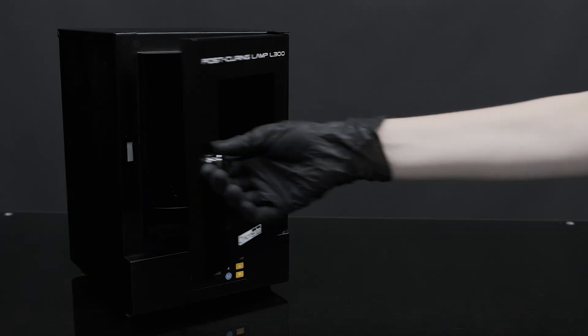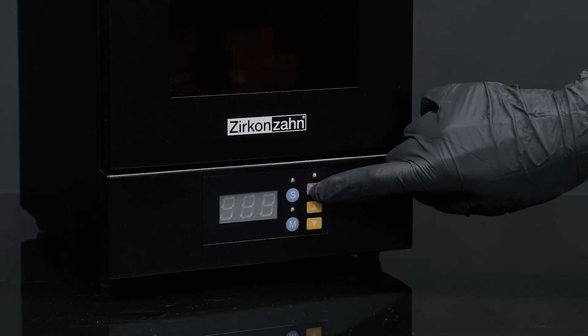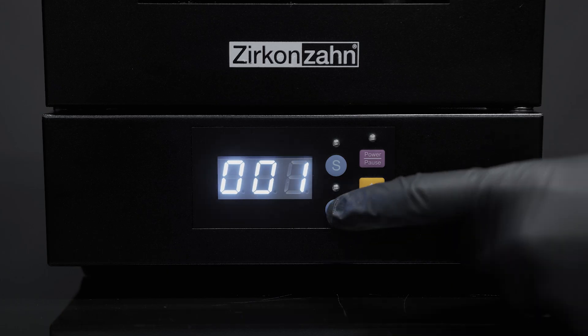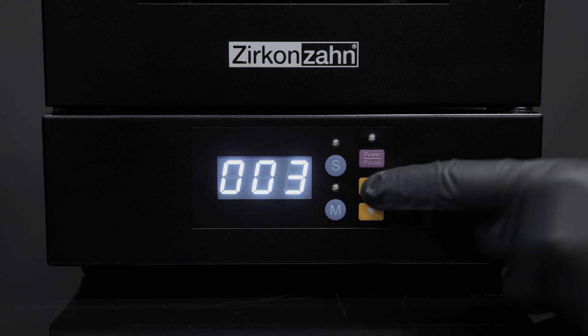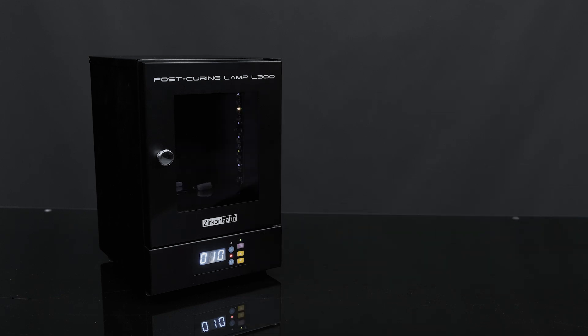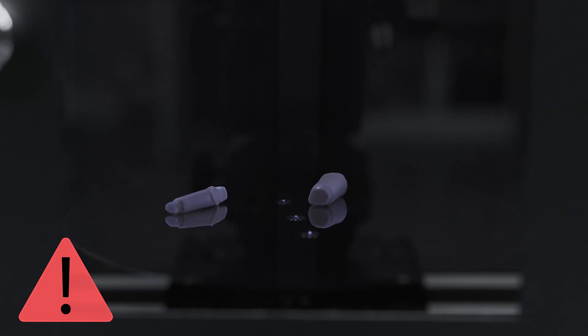Once finished, plug in the power cable of the L300 post curing lamp and cure the dies for 10 minutes. Turn on the device by pressing the power button and click on M to set minutes. Then long press the upper key to increase time quickly. Press the power button once again to start the curing process. Cure the dies separately from the model to avoid the die housing from shrinking and preventing a perfect fit.